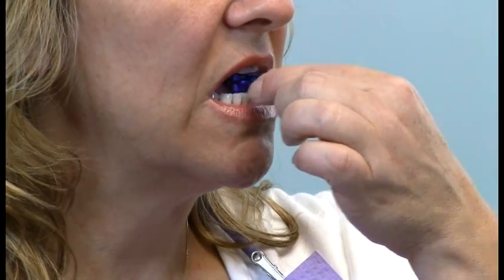Okay, now tell me how that's feeling for your airway. Just do a little breath on that. That was about a 4. About a 4, okay. And a 3 is going to be a natural airway, 4 is going to be better, 5 is even better, and then a 2 and a 1 are not so good, okay?